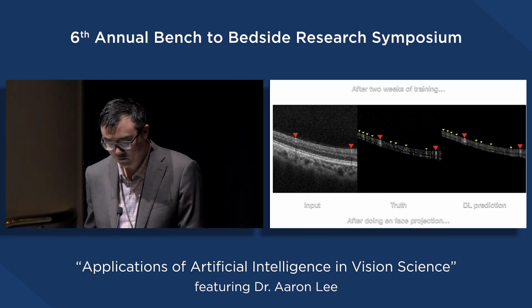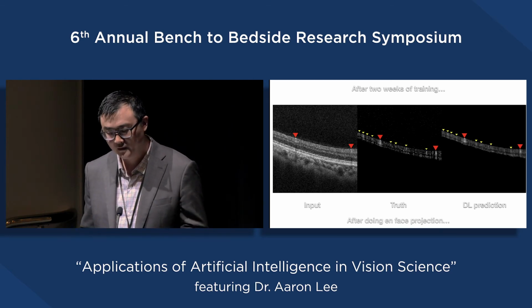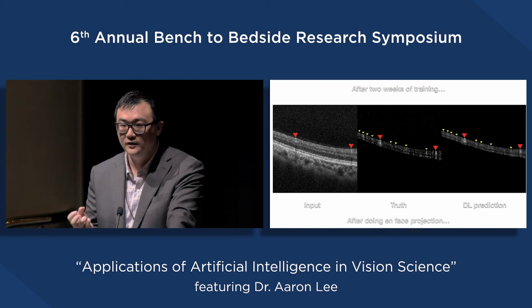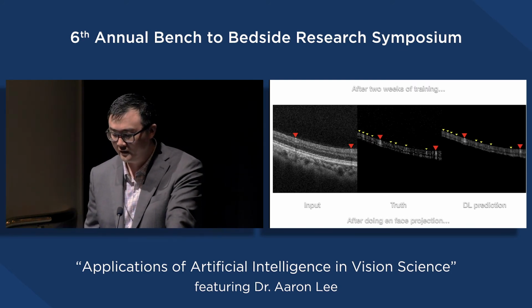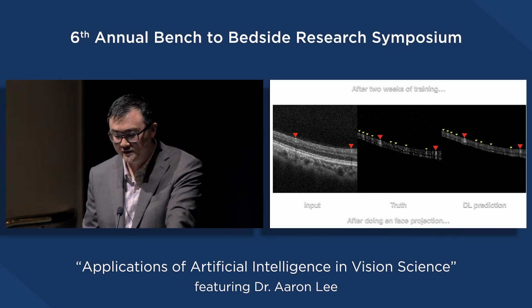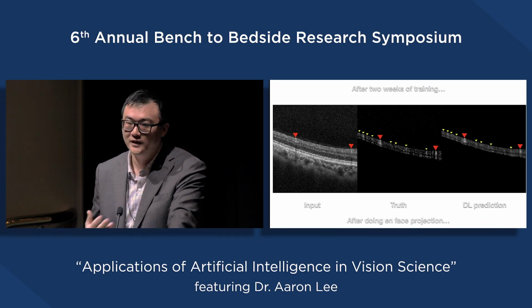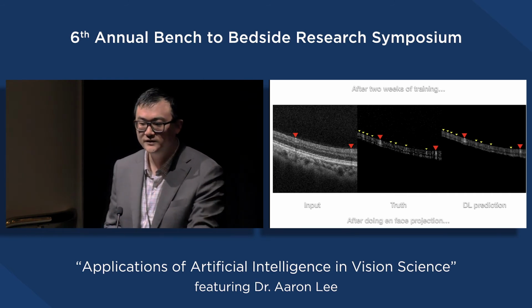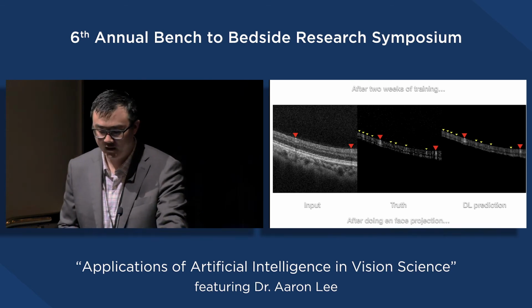So here, what I'm showing in the left-hand panel is the original structural OCT B scan. In the middle is the OMAG OCTA B scan. On the right-hand side is the deep learning prediction. And what's kind of remarkable about this is that the red arrows point out vessels that I can very easily see as a retina specialist. But the yellow ones are ones that I'm not sure I can make out in the structural B scan, no matter how much time I try to have.